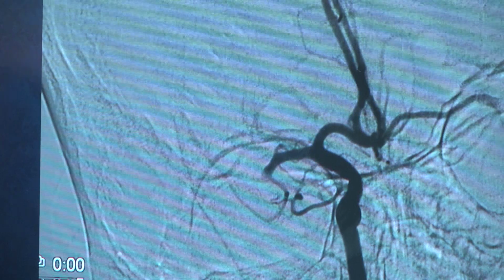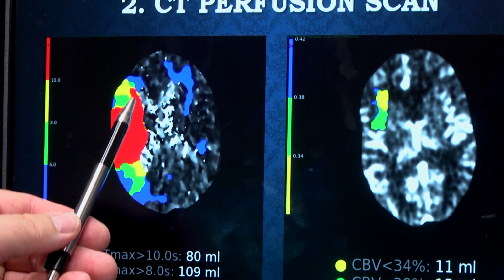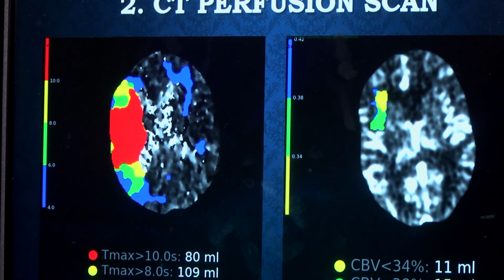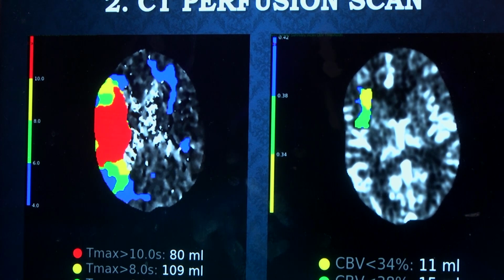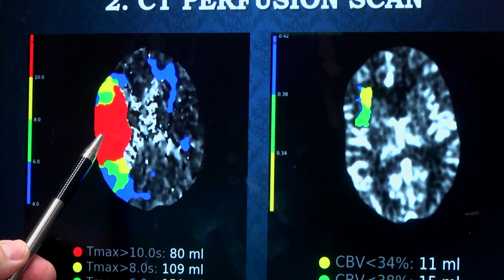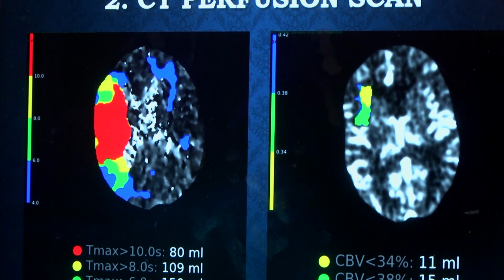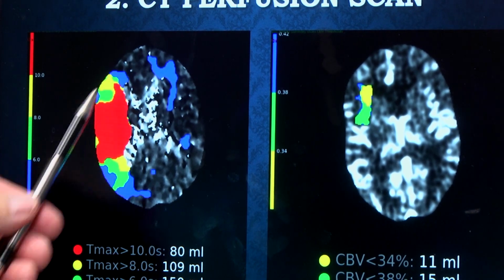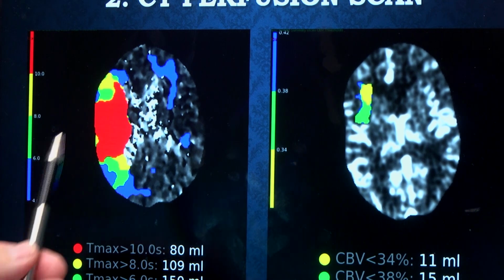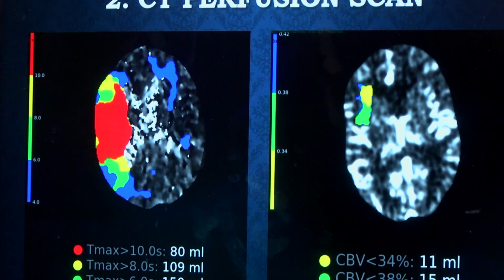cerebral hemisphere with blood. The blood flow to this area depicted with the red color, the blood flow is very much decreased, and this is either because too much time has passed since the onset of the symptoms, or the patient's anatomy doesn't supply this brain territory with sufficient so-called collateral flow that would make it possible to survive for that brain territory for an additional few hours until help arrives.